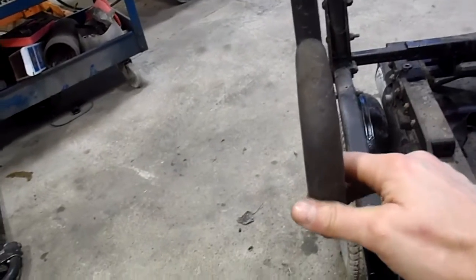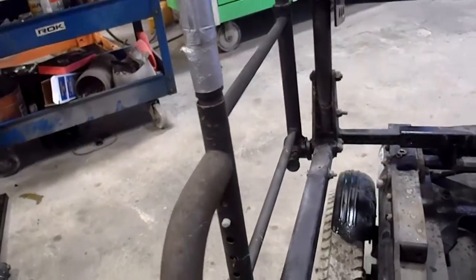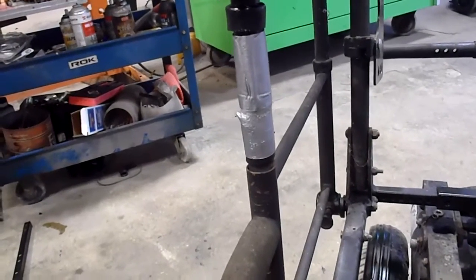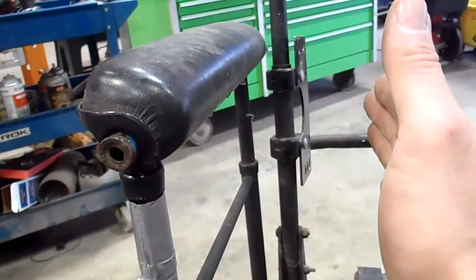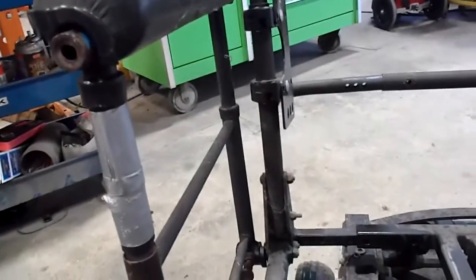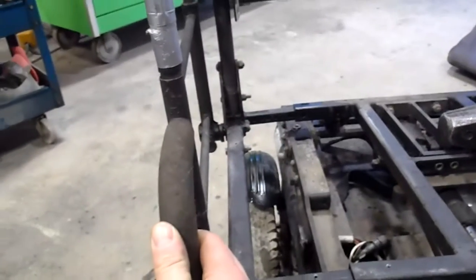I took the bottom mount off there, so it's not going to stay there until it's folded. But anyways, I can keep these factory armrests down. I might modify them a little bit just so they stick out a little bit further, or maybe they stick in a little bit this way, like in here. I'll just make a bend. I don't know yet. I got a long ways to go on this thing, and it's early in the game. I'm just dismantling, but you can see that you can swing those out fairly wide. So just leave that there.